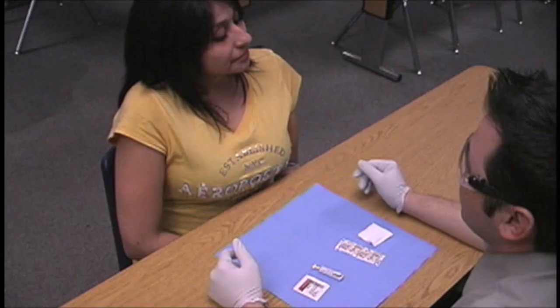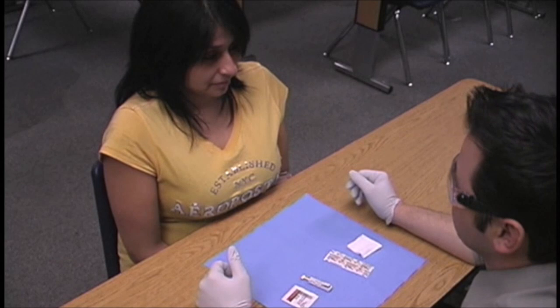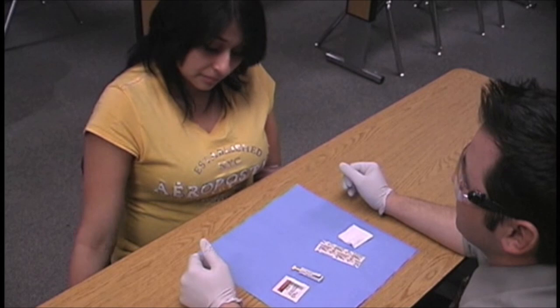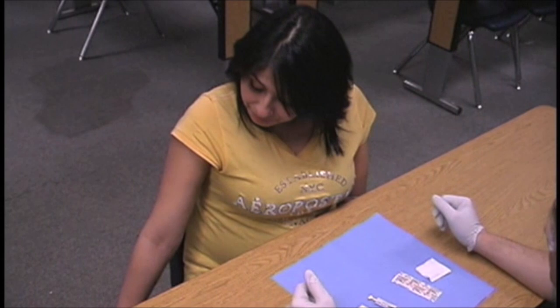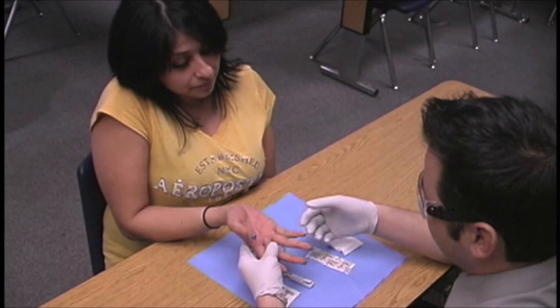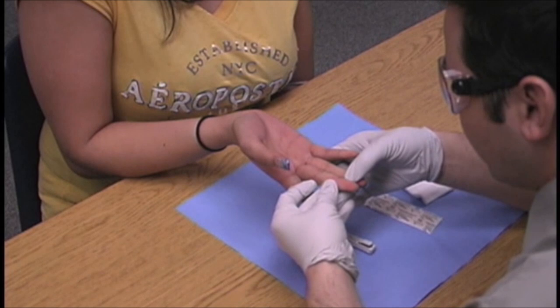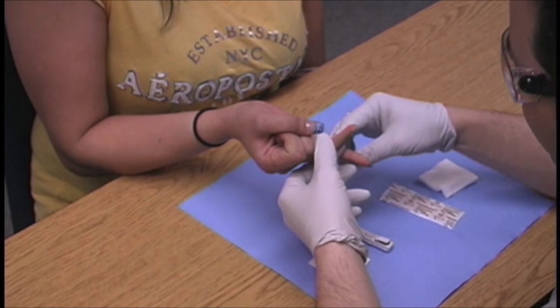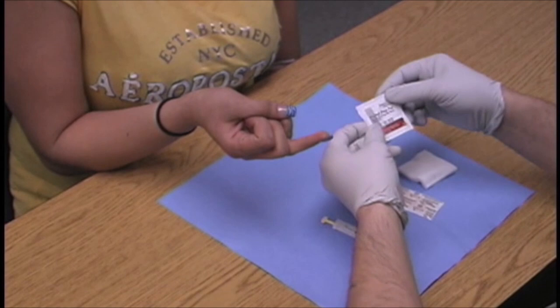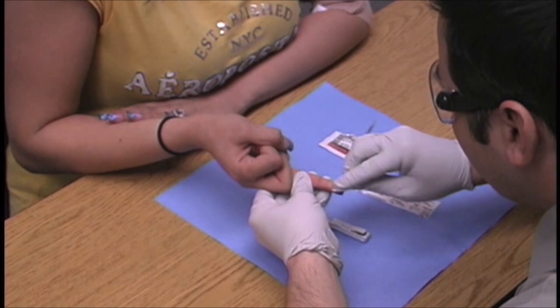We're now going to demonstrate a skin puncture with Veronica and Al. First, we have Veronica dangle one hand down at her side to cause capillary congestion and bring blood to the distal tip of her finger, then bring her hand up. Al examines the middle or fourth finger of the non-dominant hand, looking for an area that's not scarred, edematous, or traumatized. Once Al establishes which finger to use, he picks up his 70% isopropyl alcohol, reads the label, opens it, and preps the area.